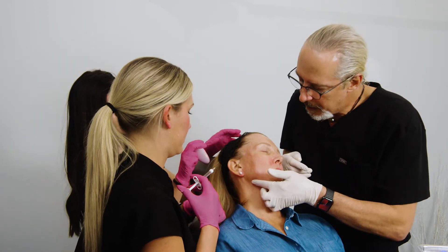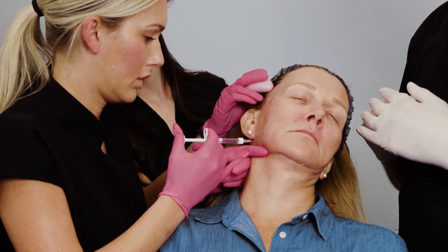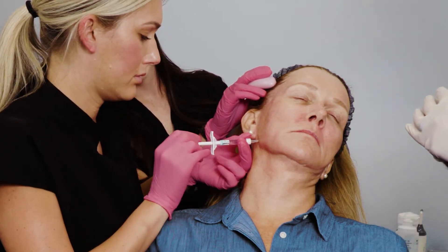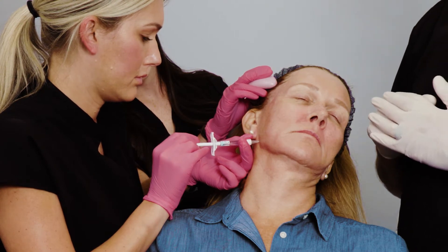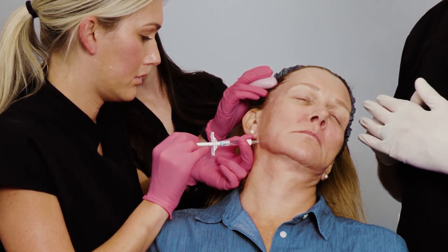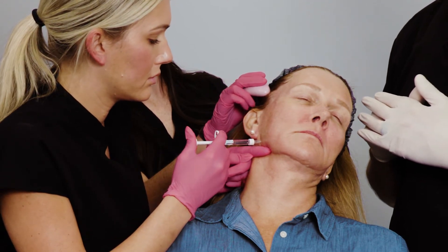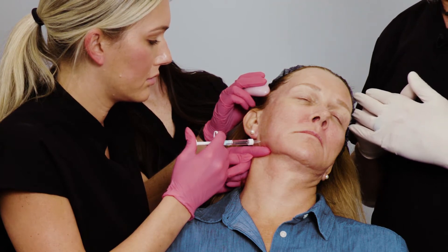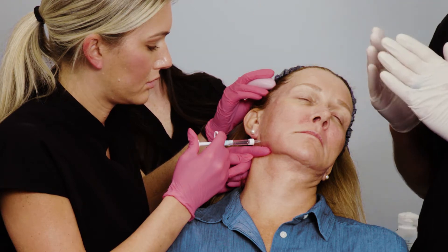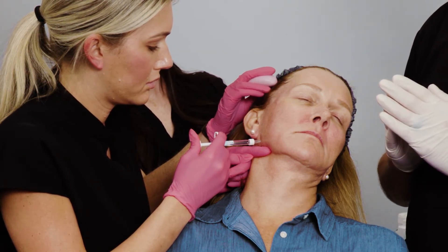There's the artery and we've identified it, and now we're going to go down onto bone. You can aspirate if you'd like - in this position we can just inject straight down. We'll do it towards the gonial angle and go a little anterior to that as well. There's the 0.25cc.